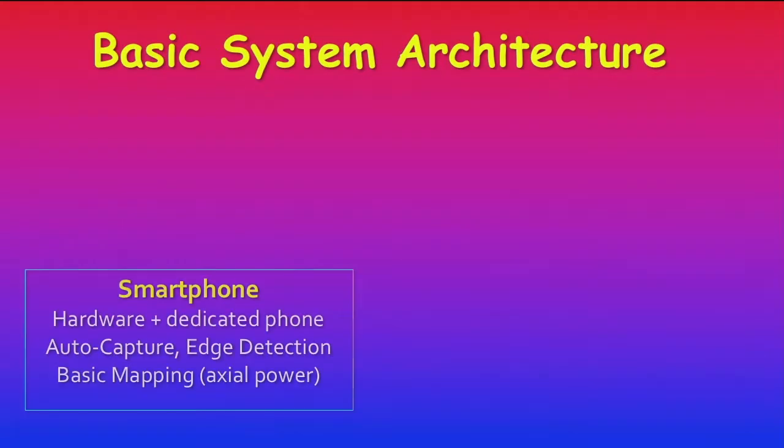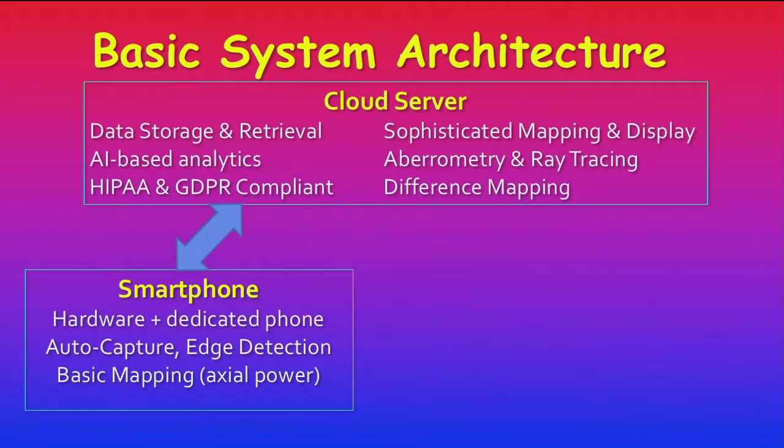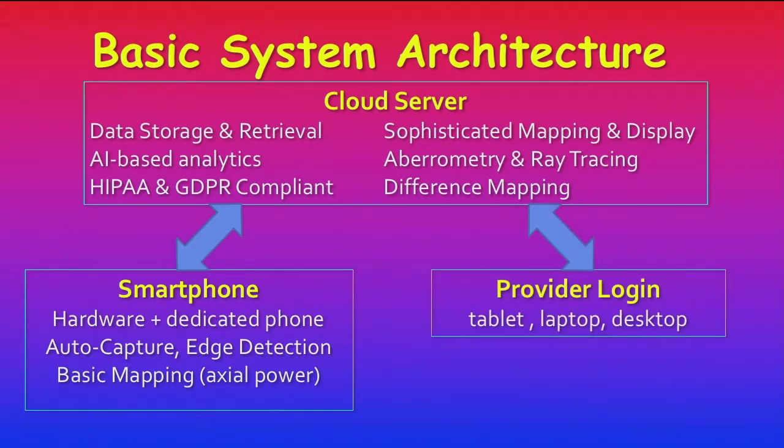Basic system architecture of this device, as I said, it's smartphone based, and one of the nicest features is it has an auto capture system. The technician sits on a slit lamp, moves it around, and boom, it captures the image automatically. After the image is captured and approved, the exam is sent to a cloud server where the heavy-duty calculations are done for the various types of displays. And all of the displays are available then remotely to the provider with basically any device that has a web browser on it.